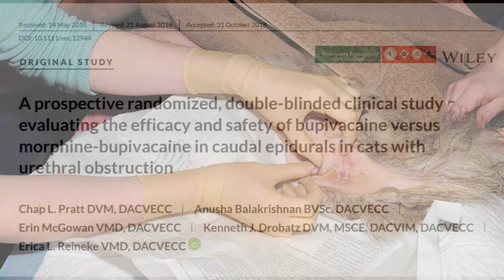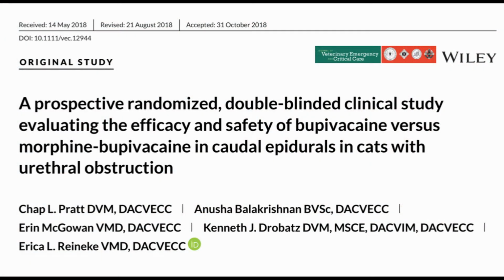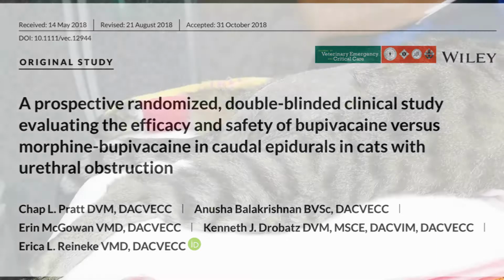There was a recent paper in JVECC 2018 that showed that this was a safe procedure that helped to reduce intravenous anaesthesia requirements in cats.